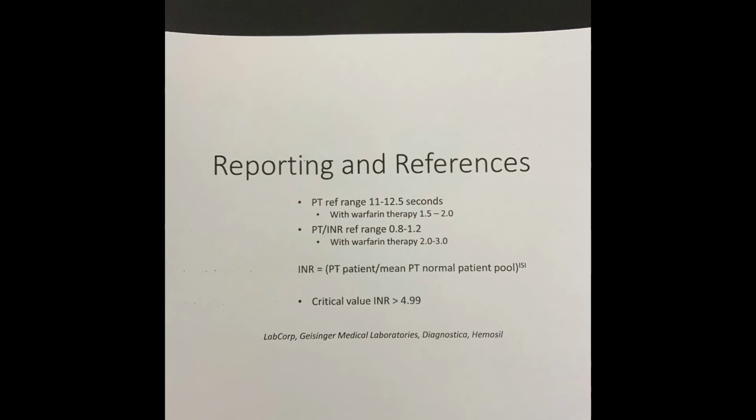The PT is a great test for, of course, the extrinsic and common pathway in general, components of that. It's also a great test for liver function because so many of the factors are produced in the liver, and the half-life, for example, of factor 7 in particular is very short and affected by that liver function. And so a great assay for testing liver function and determining if your patient is at risk potentially for bleeding or coagulation, and if so, what factors may or may not be involved.